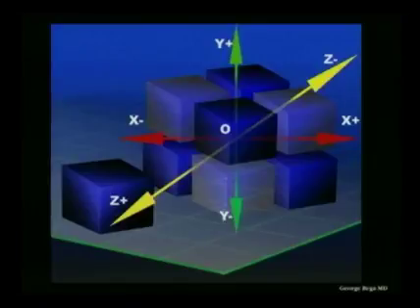A very important implication here also is the fact that these voxels now really float in space. Now I have a true volumetric imaging object that I can manipulate. I can put a pivot point at any single point of these voxels. I can twist, I can turn these voxels. I can look on top of them, I can look below them. I can shine a light source.